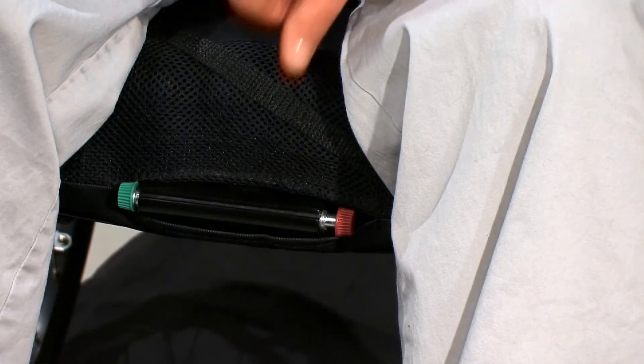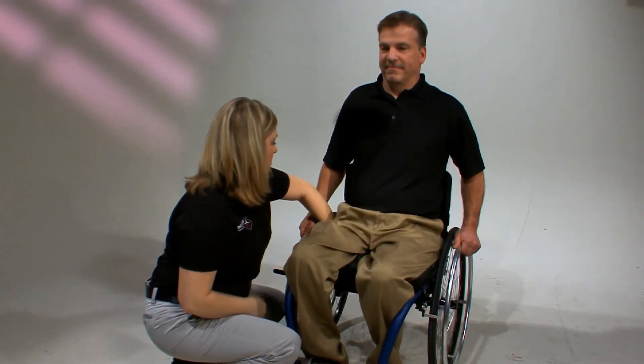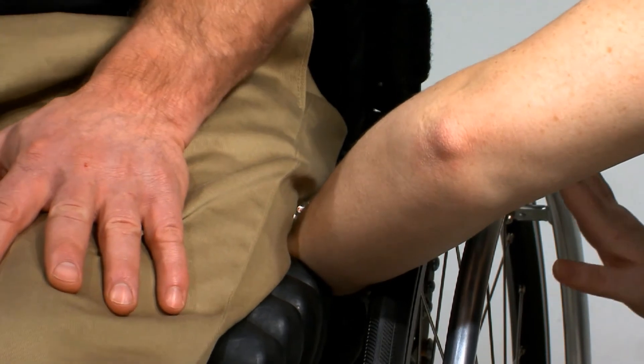Finally, if an individual has a fixed pelvic deformity, follow the steps for proper inflation. In order to capture the pelvic deformity, you must lock the Isoflow by pushing the red knob to the left. This allows the cushion to adapt to a variety of pelvic positions. Always follow up with a hand check under the lowest bony prominence to ensure you have maintained at least half an inch (1.5 centimeters) of space between the individual and the bottom of the cushion.